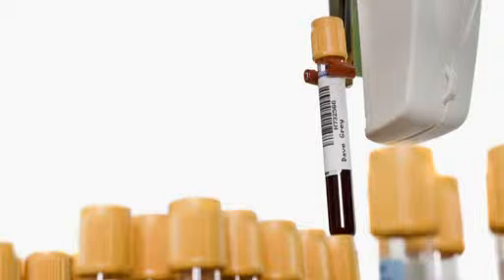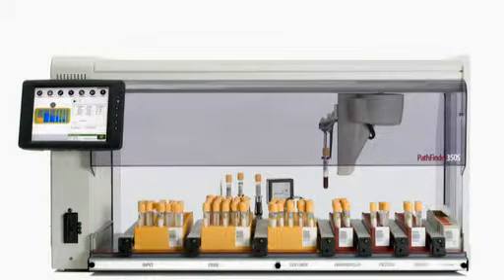So with a blood sample, as most people are aware, when you go to the doctor and collect blood samples for the laboratory, a patient can easily have up to 9 different tubes, and those tubes, when they get to a laboratory, some busy laboratories have up to 16,000 tubes per day that all need to be split into where they go in the laboratory.